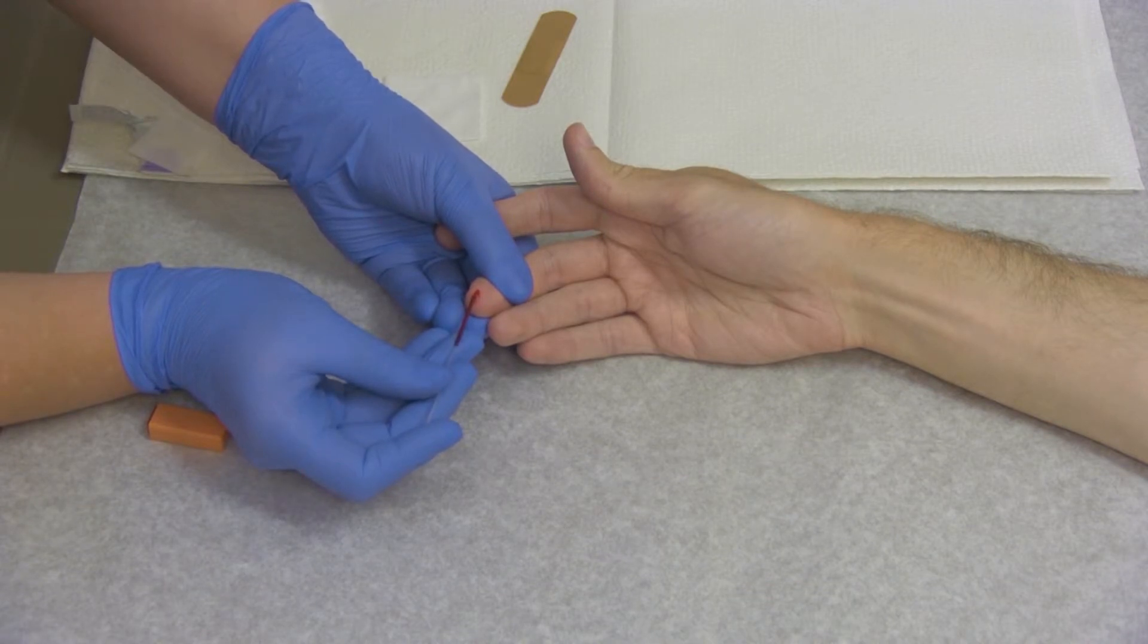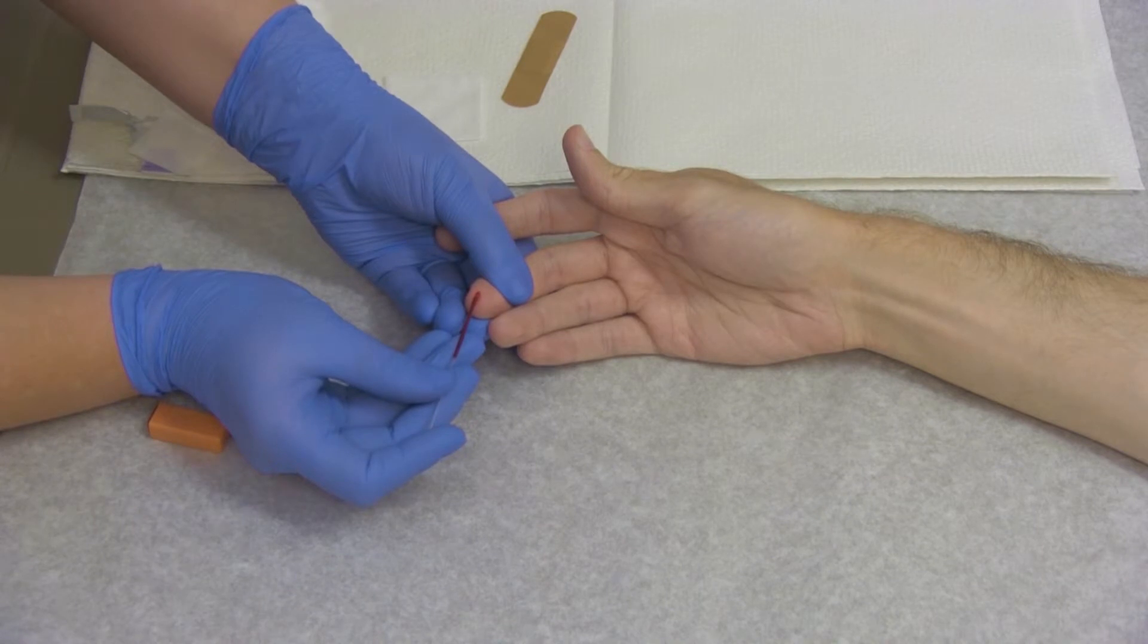Allow it to fill two-thirds to three-quarters full, keeping it at an angle. Place one of your fingers over the end of the tube to keep the blood from coming back out.